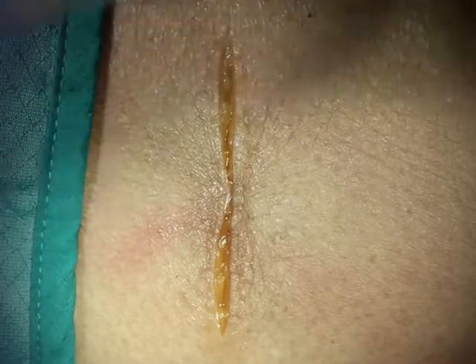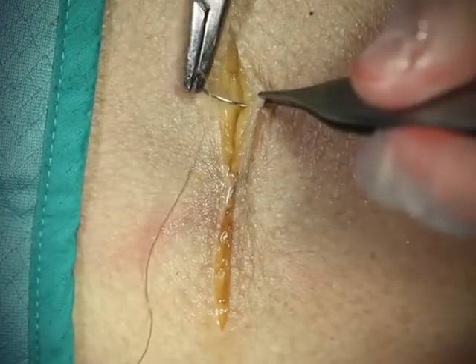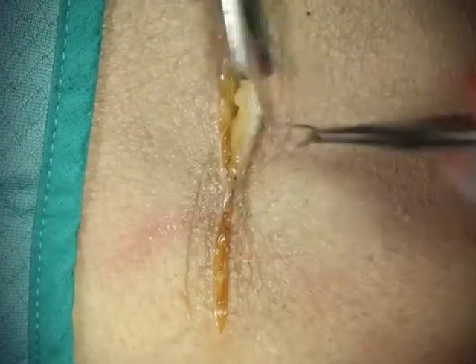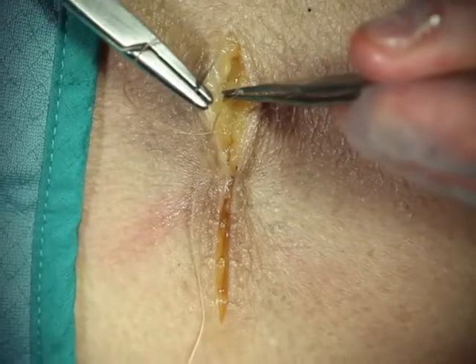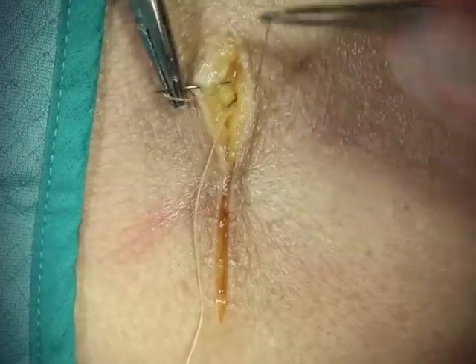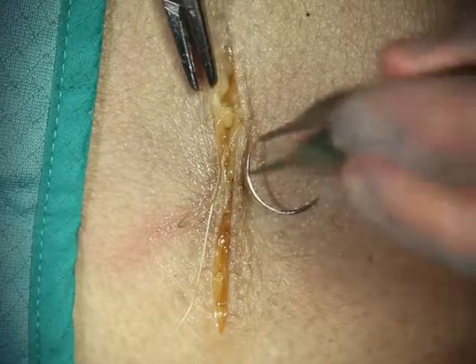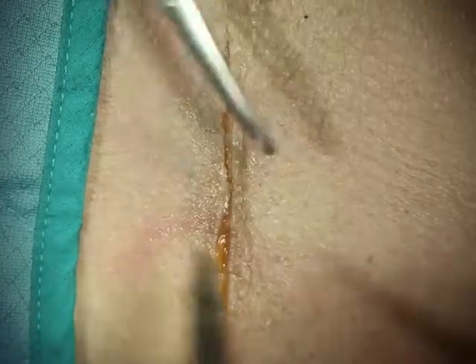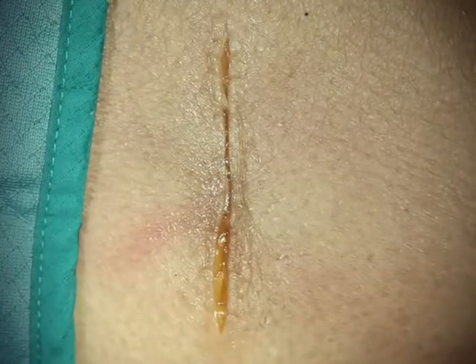Let's do one more. Go from deep to superficial without buttonholing the skin, and then from superficial to deep. Make sure that you're coming out on the same side of the loop. Do your instrument tie and pull it along the length of the wound so it'll allow it to bury. That is our simple interrupted buried suture.